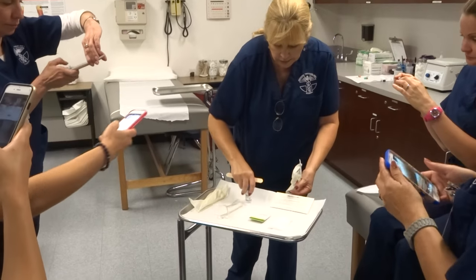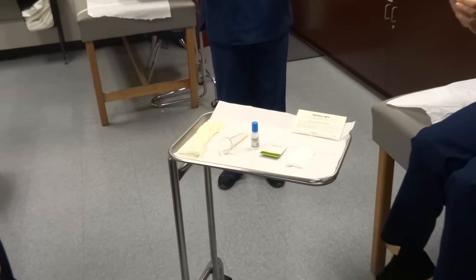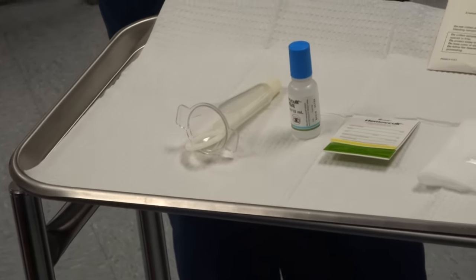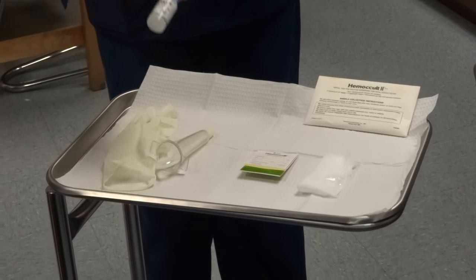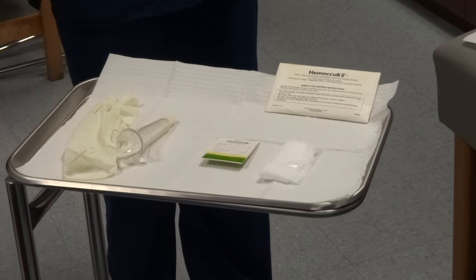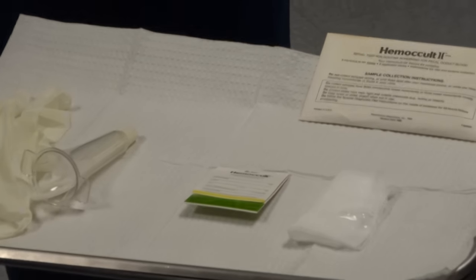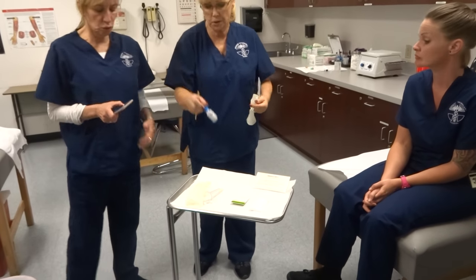That is it. This would be going home with the patient if they have a problem. It's not hard — just think through the process. What's the most important thing on the tray? Gloves. What is the name of this again? It's called Guaiac. It's not written on there? It should be. On the NCCT they refer to Guaiac and you're supposed to know what it is.